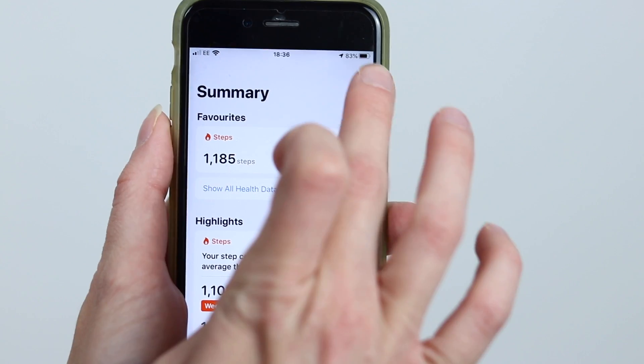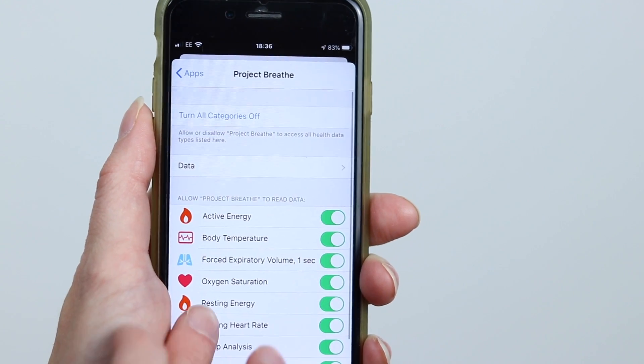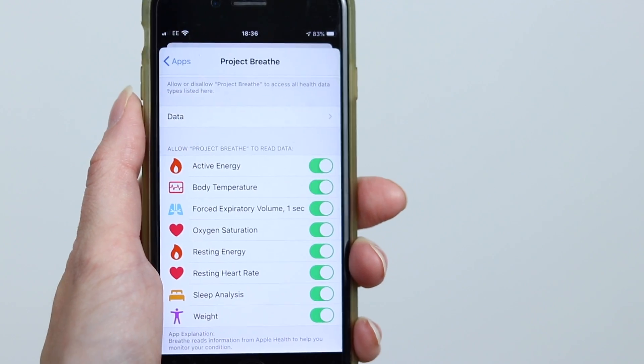If you've connected Breathe to Apple Health, be aware that Breathe will only see data that is visible in your Apple Health app — so if you're having problems, that's a good place to start. First, check that Breathe is allowed to read data from your Apple Health store. In your Health app, tap your profile icon in the top right, and under Privacy, tap Apps — Project Breathe should appear in this list. Check that Breathe is allowed to access any data you want it to read. It's also a good idea to check that any devices or apps that work with Apple Health are set up properly. If you wear an Apple Watch, make sure it's unlocked and linked to your Health app so data can sync throughout the day. If you use apps to track sleep, or devices such as spirometers, oximeters, or thermometers, check that they are set up to write their data to Apple Health — sometimes you need to open Apple Health to sync data coming in from other sources.